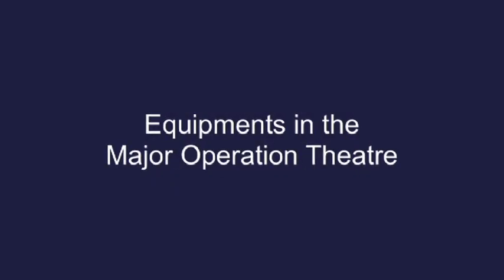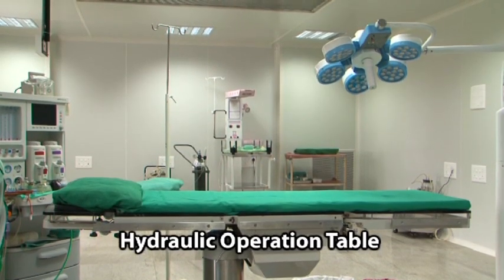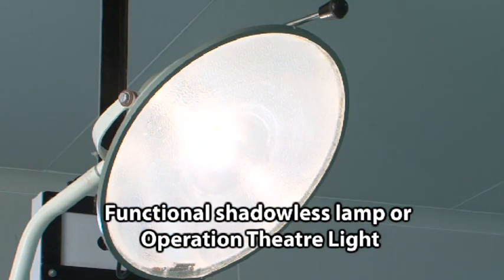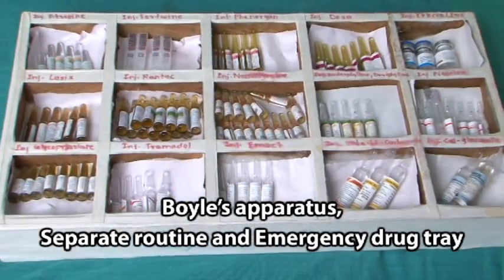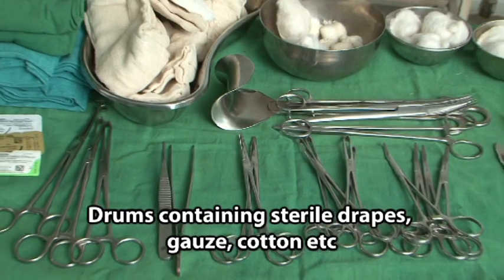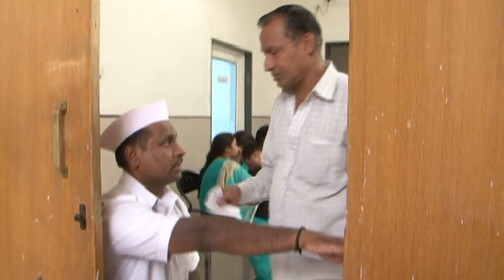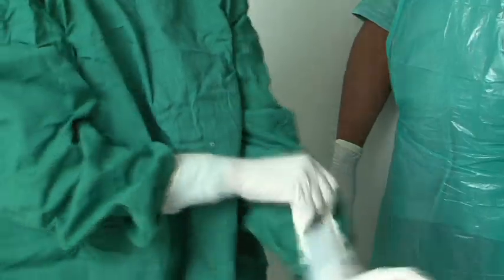Equipment in the major operation theatre: hydraulic operation table, functional shadowless lamp or operation theatre light, Boyle's apparatus, separate routine and emergency drug tray, anesthesia tray, drums containing sterile drapes, gauze, cotton, etc. General measures: unnecessary entry must be restricted. Proper occlusive clothing of operation theatre personnel necessary.